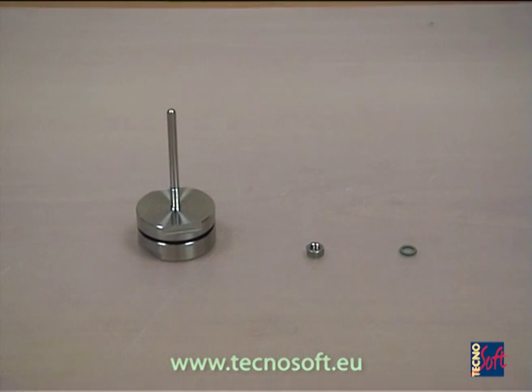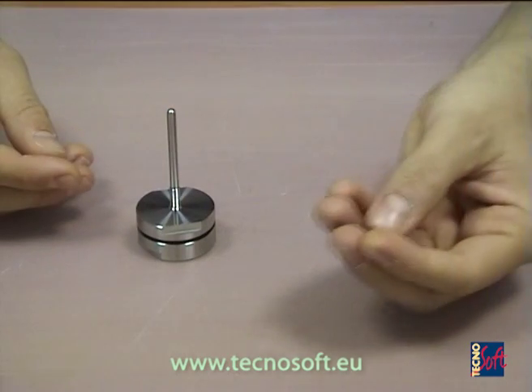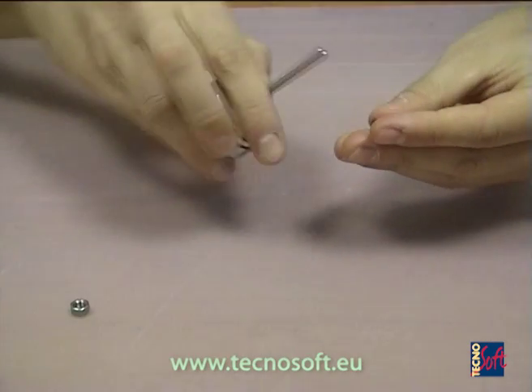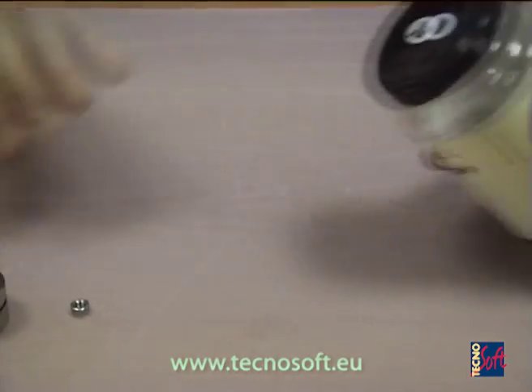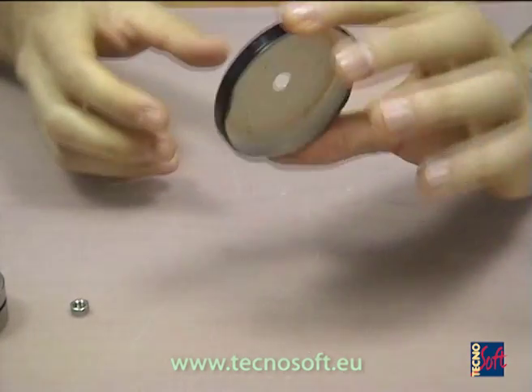If we have an open container where we can act both on the inside and the outside — like the cap of a jar — we can use a threaded probe and counter bolt to fix the logger to the surface. We put an O-ring on the threaded part of the probe, take the cap, and put the probe in the hole.